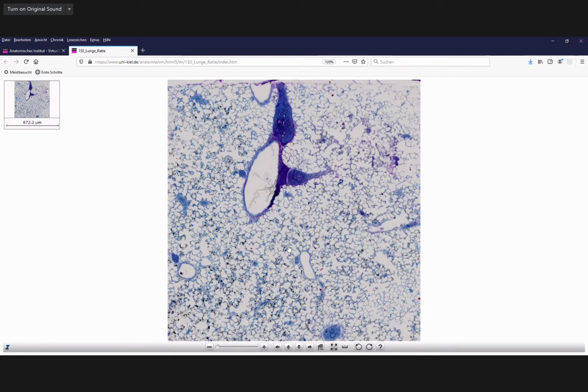The macrophages have stored some coal particles again, so there are some inert particles, black particles, which could not be broken down by the cells, so they have accumulated all this. And you can see now where the cells are that actually phagocytize everything that manages to get all the way to the alveoli.